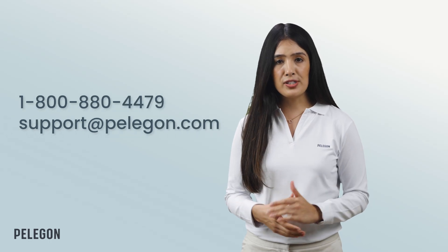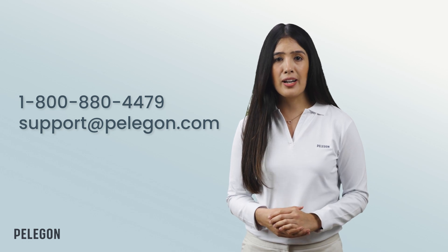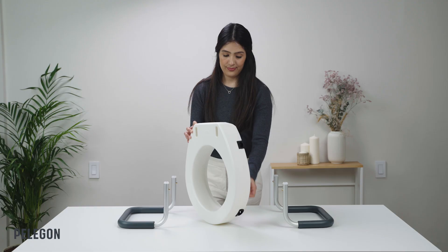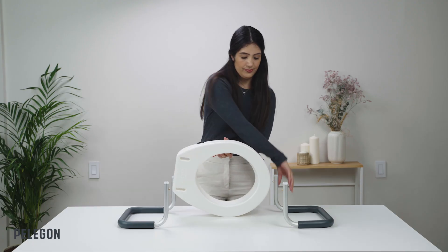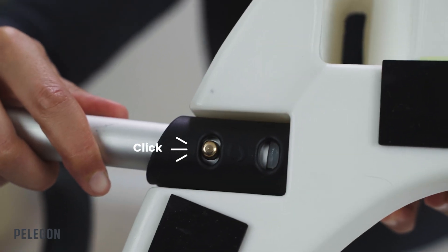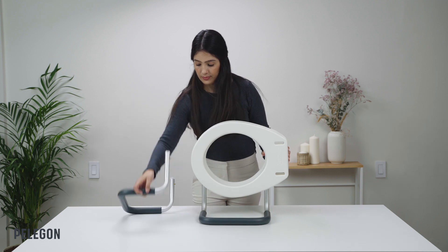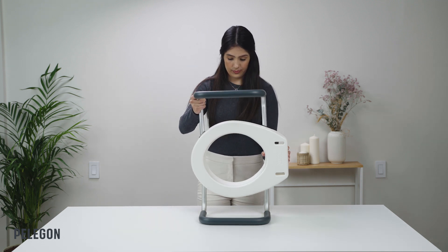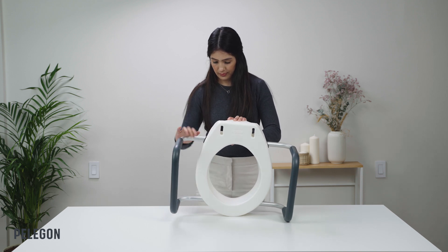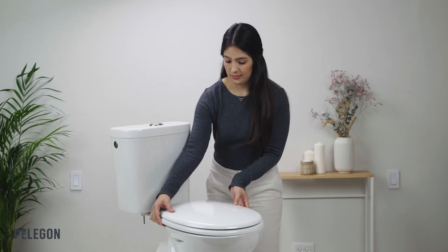If you think that any parts are missing or damaged, please contact us at Pelegon Customer Support and we'll take care of it for you. First, attach both handrails to the seat. Notice the stickers as you do so.